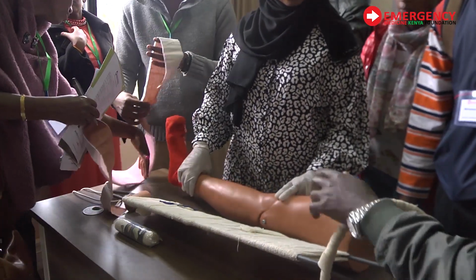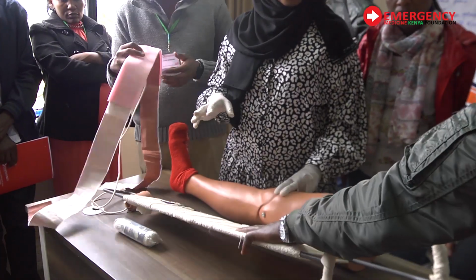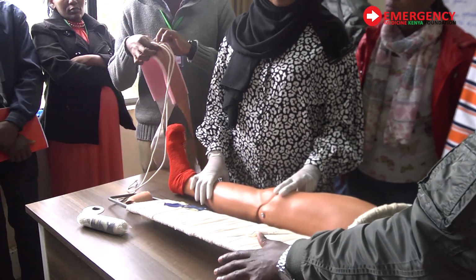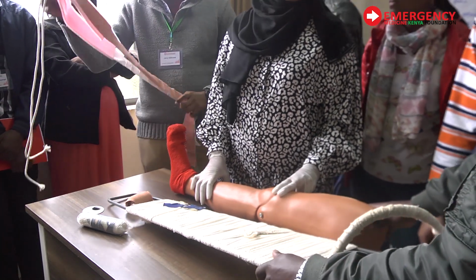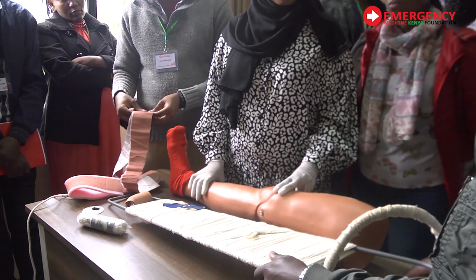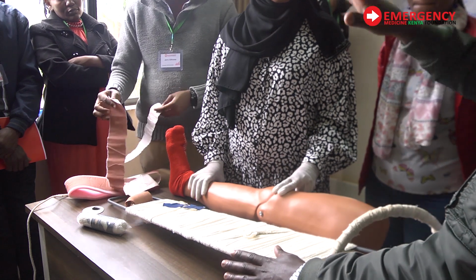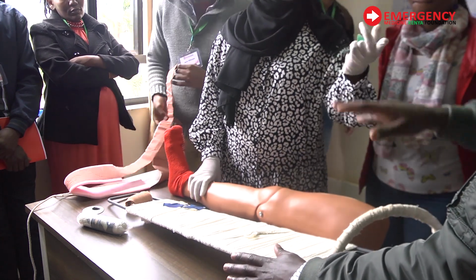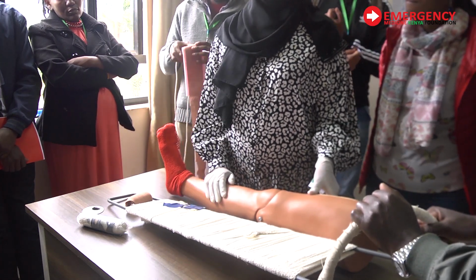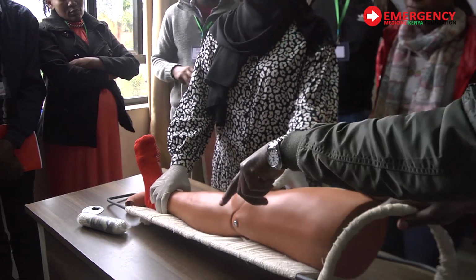I have a question. Whenever I don't have skin traction, what do you normally have? I know there's the Thomas splint only. So how do you, is there something you normally put, like a block? Do you do any traction in your facility? No, only splinting. You transfer. I think the best thing is to splint rather than to put a Thomas splint. Just splint. Because by putting my legs up here, you're not helping me in any way.